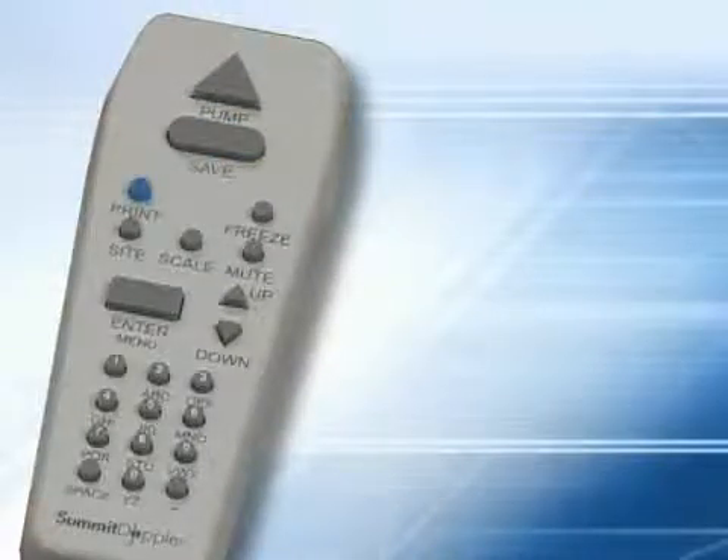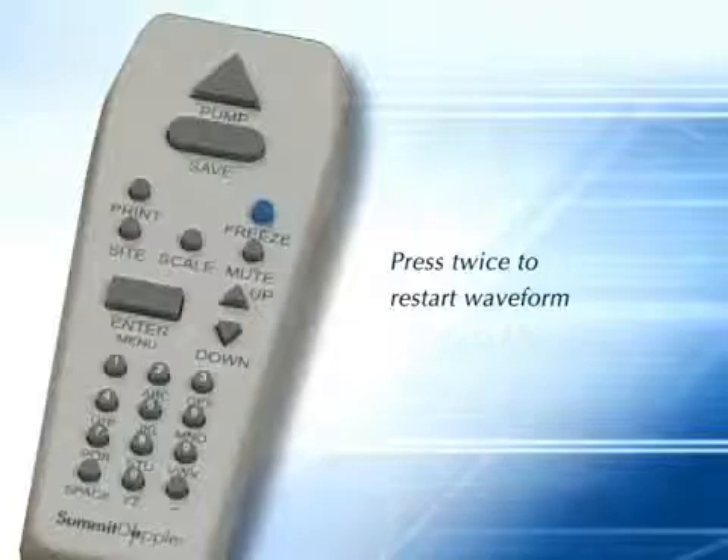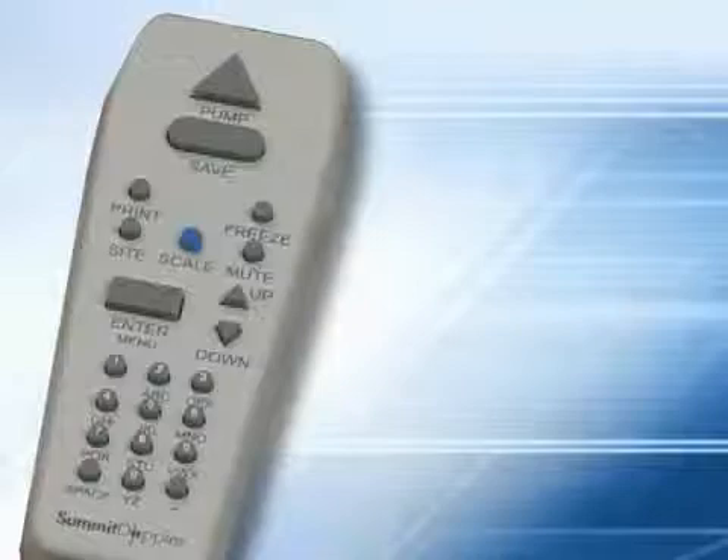Press the print key to print both pressure and wave form data from the built-in printer on special adhesive-backed label paper. Pressing the freeze key while you have an active wave form will freeze the displayed wave form; press freeze again to restart the wave form. The site key moves the protocol marker to the next location, and data is saved before moving from the current location. Press scale one or more times as needed to adjust the vertical scaling to obtain a wave form as large as possible without clipping at the top. The mute key enables and disables the Doppler audio output.